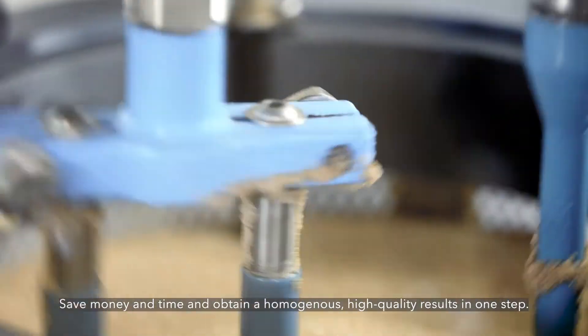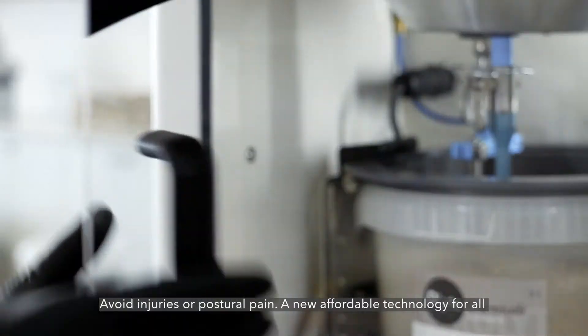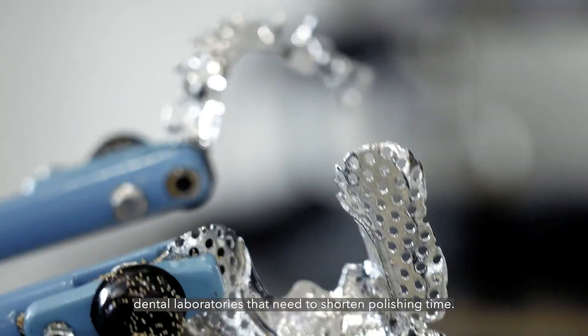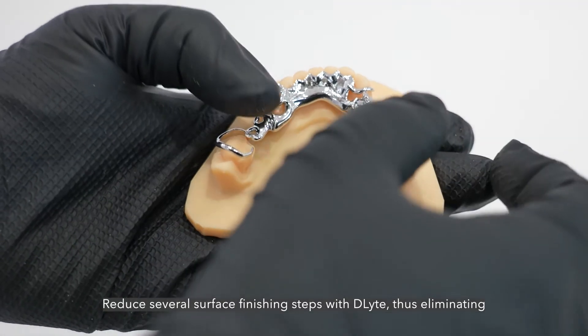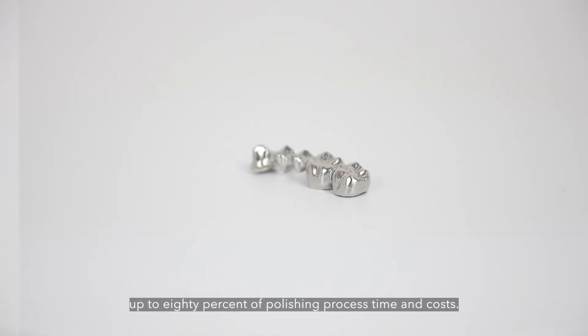Save money and time and obtain homogenous, high quality results in one step. Avoid injuries or postural pain. A new affordable technology for all dental laboratories that need to shorten polishing time. Reduce several surface finishing steps with D-Lite, thus eliminating up to 80% of polishing process time and costs.